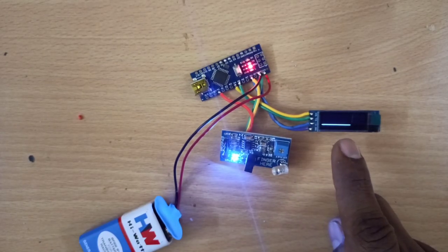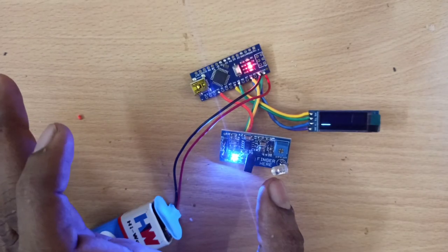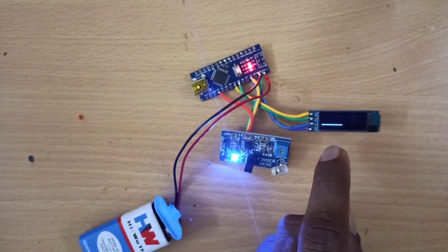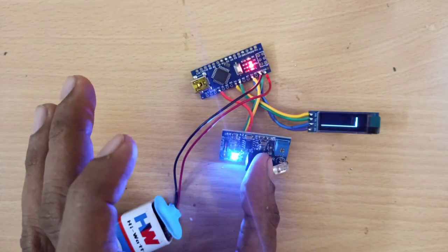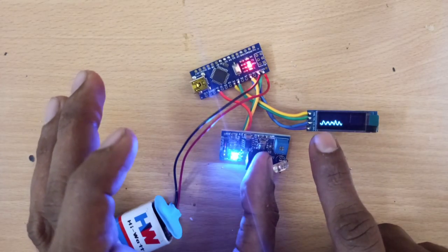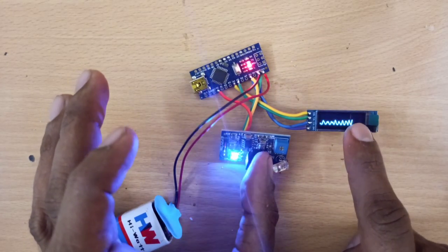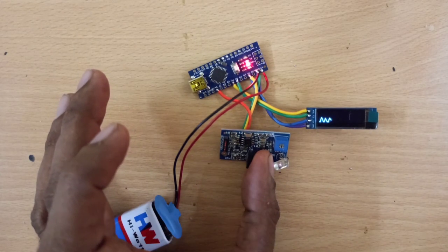See the straight line running in the display. So when we place the thumb finger in between the sensor, we can see the PPG waveform in the LCD. See, now we are getting the PPG waveform. Also, based on my heartbeat, the LED is blinking.